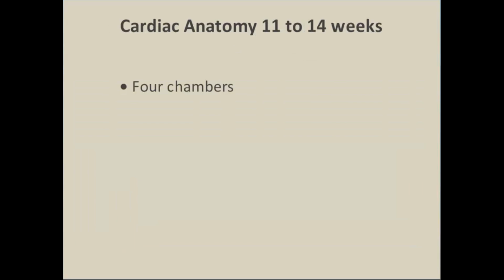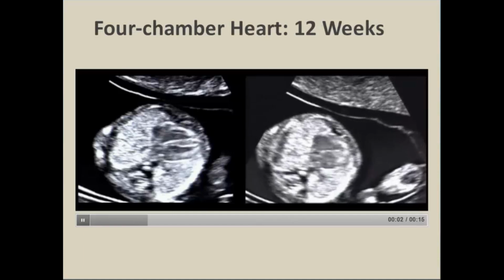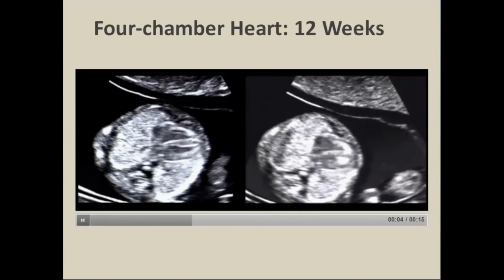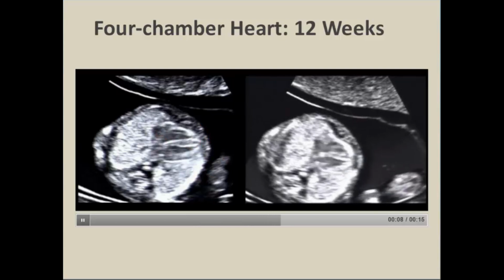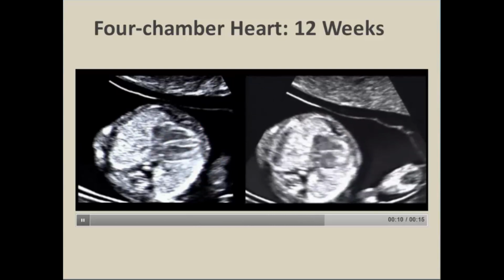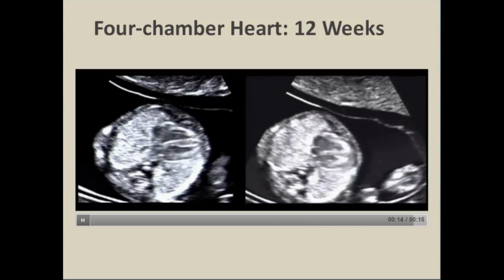We also can see the heart, particularly if we do a transvaginal scan. Here's a beautiful 4-chamber view of a 12-week fetus done with a transvaginal scan. The 2D and the clip both show an intact septum, nice normal shaped ventricles and atria, normal size, symmetric.